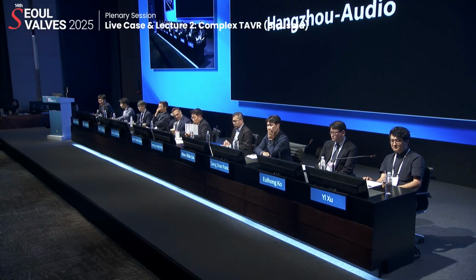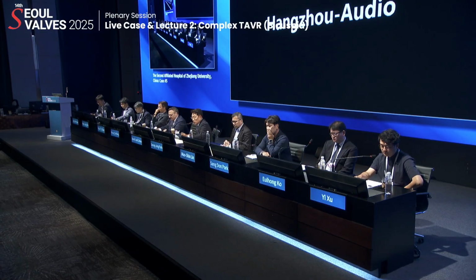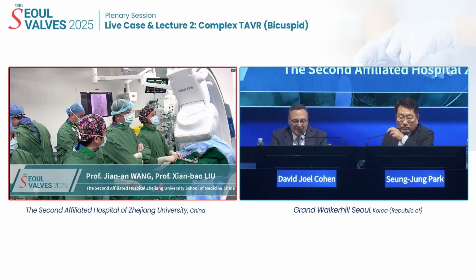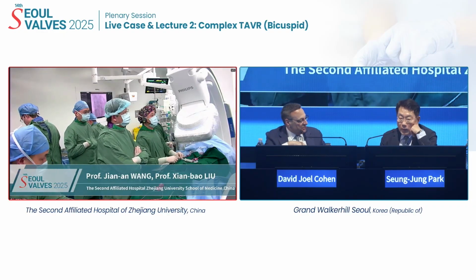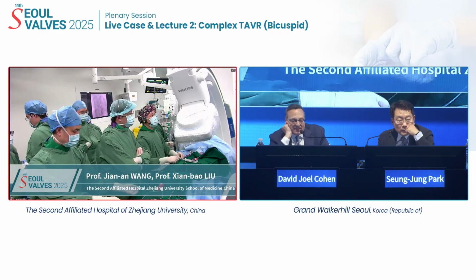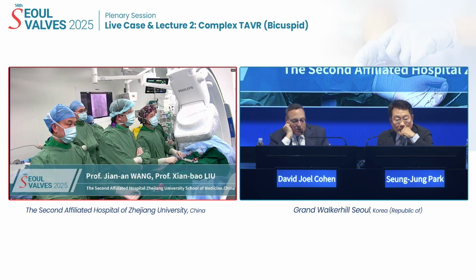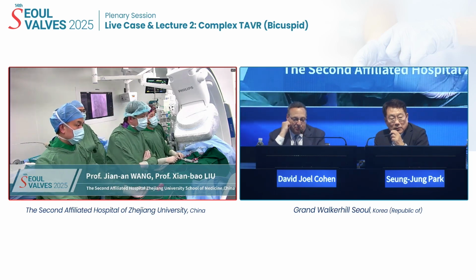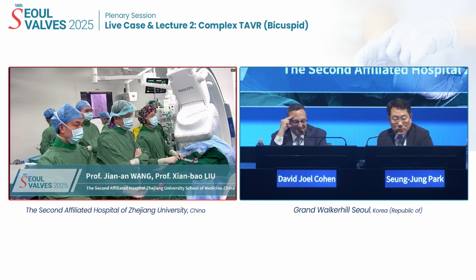We're going to move to China, Second Affiliated Hospital, Zhejiang University. Dr. Jian Wang, can you hear me? Hello, Dr. Wang. Yes, go ahead. Thank you all for joining us. This is David Cohen, and my co-moderator is SJ Park, and we have a great panel here, so we're looking forward to your procedure. Thank you for joining us, Dr. Wang. All right, we'll just start.